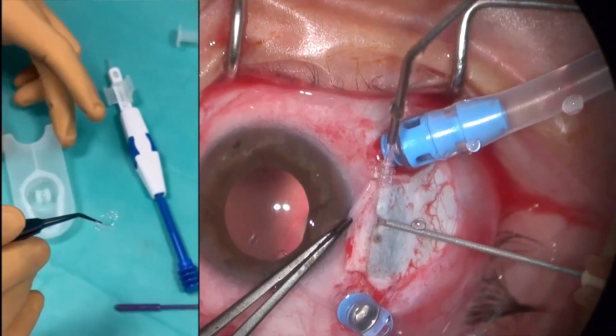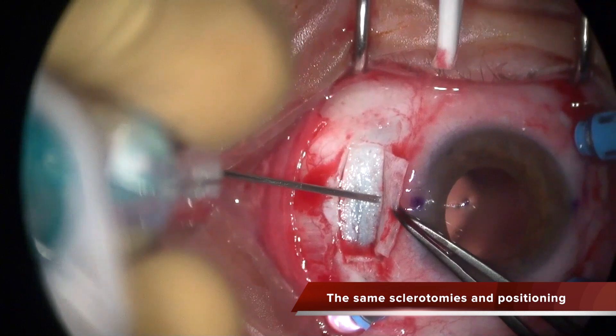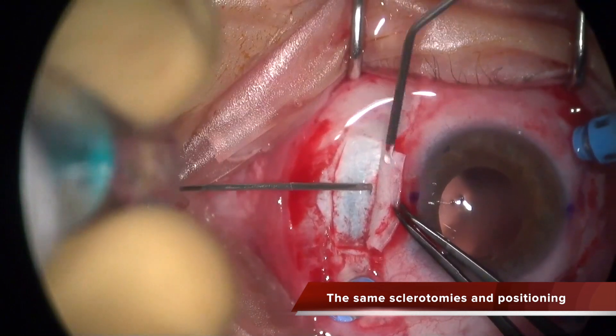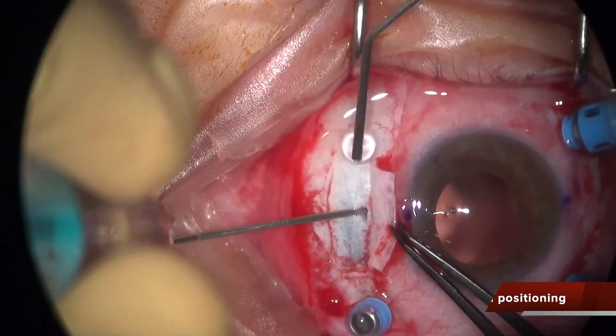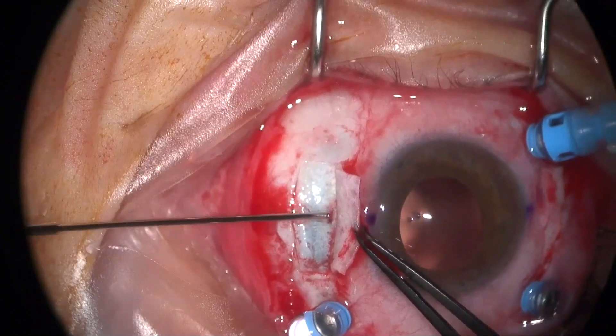The sclerotomies to take out the plugs are located at exactly the same position and the technique to perform them is the same. I'm also taking the plugs out with the 25G serrated forceps.